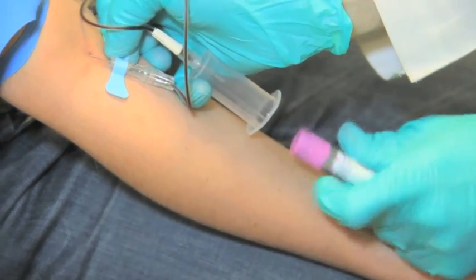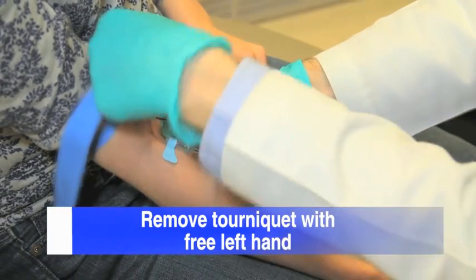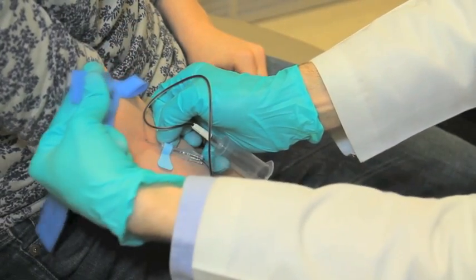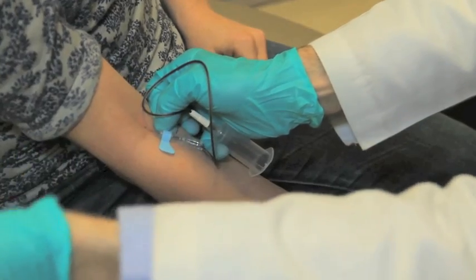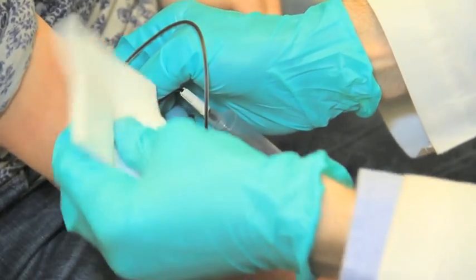When you have finished collecting your specimens and are ready to withdraw the needle, release the tourniquet by pulling the end of the loop superiorly. If it was properly tied, the tourniquet should come off easily. If you remove the needle prior to releasing the tourniquet, blood can splash at you since it is under pressure.